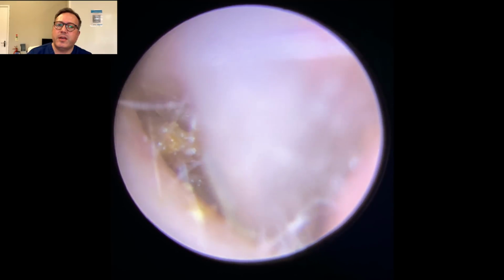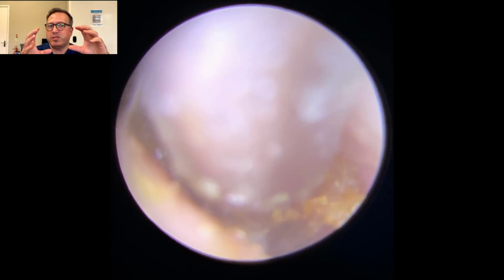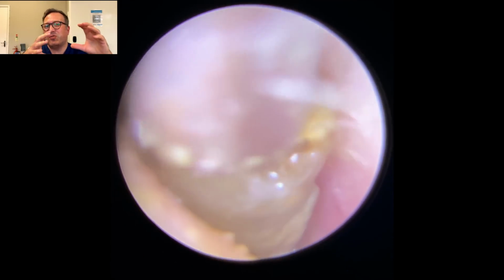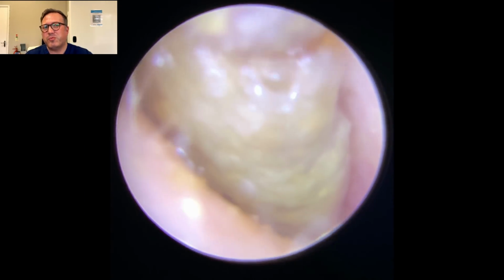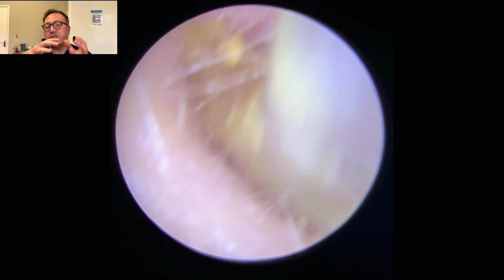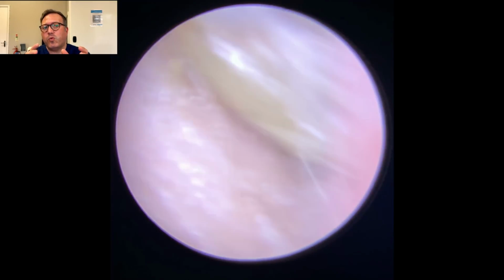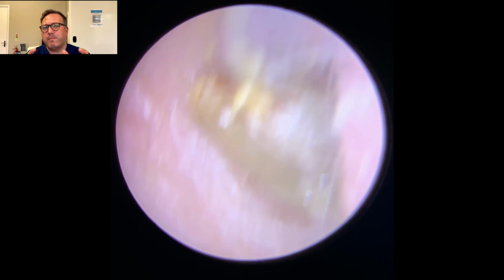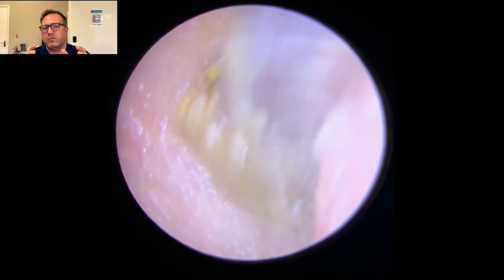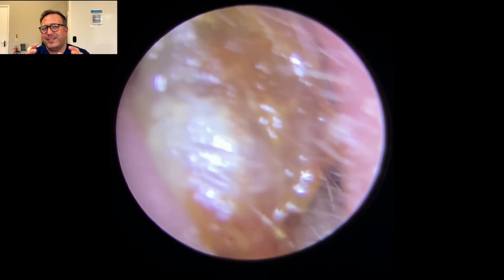So we're having to use the suction tube now to get this out. You can see it's actually caused it to go further in, which is going to cause us more problems. But as it's tipped over, we're going to aim for this slightly smoother section, slightly softer section now the oil's penetrated into it. And then we're going to wiggle this up and down, back and forth. It's almost, there you go, just about there you go.